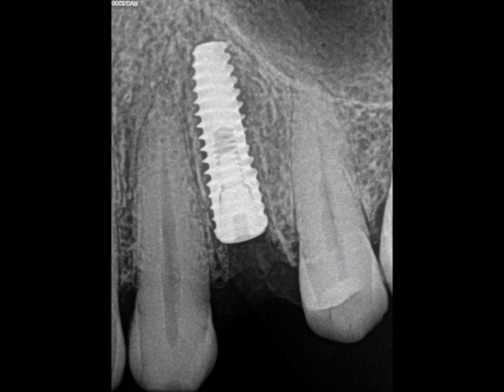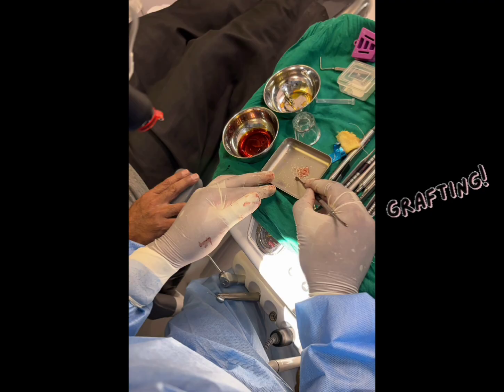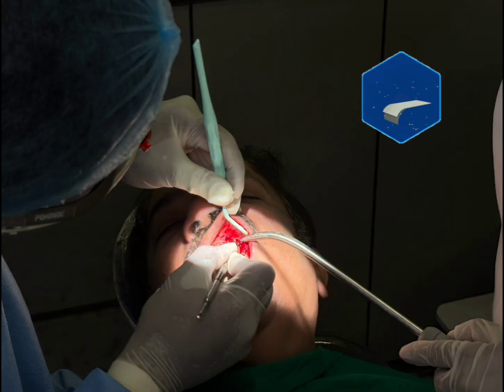Following implant placement, the jumping gap as well as the buccal defect were grafted using a mixture of autogenous bone and allograft. A collagen membrane was placed over the graft, followed by tension-free primary closure.